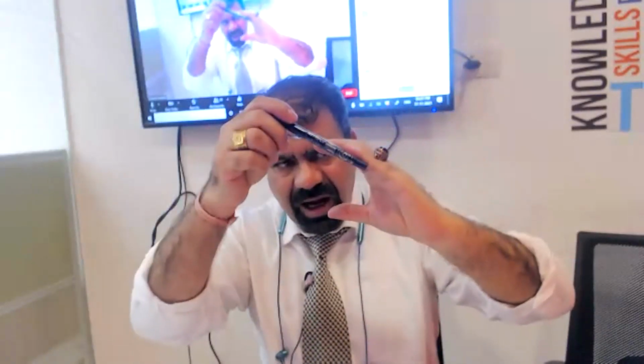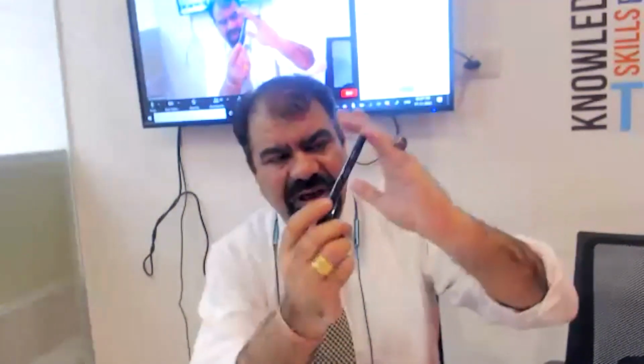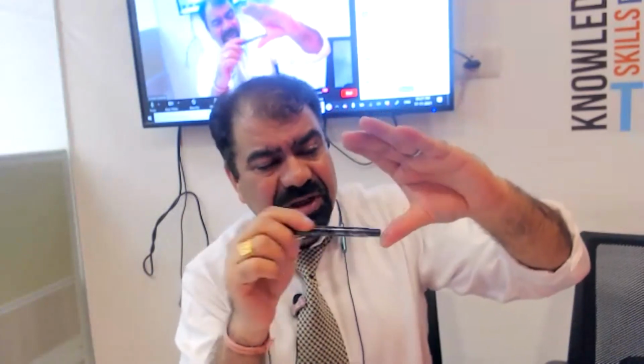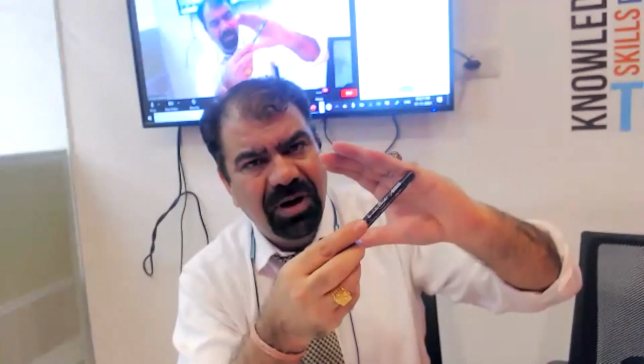Same is the uterus. Uterus is also a curved structure. When I am inserting a probe, TVS, Dr. Tania, when I'm inserting the probe, I may be cutting this way, thereby the fundus, body, and this thumb will be missing from the screen. This cervix will be missing from the screen. Once I am cutting through the cervix, this top and the mid part will be missing from the screen. Clear?